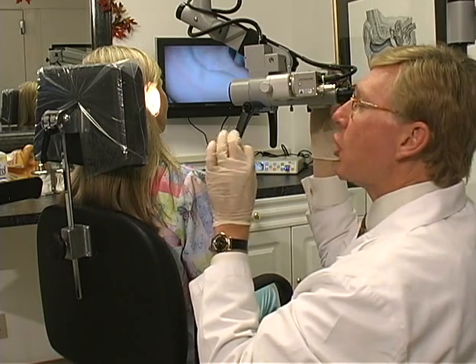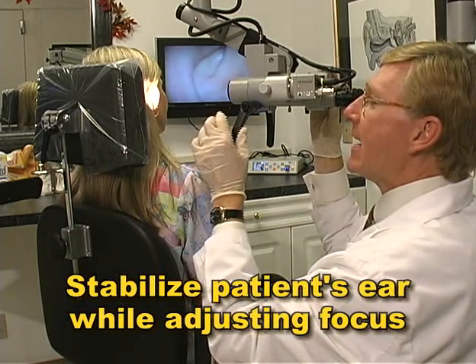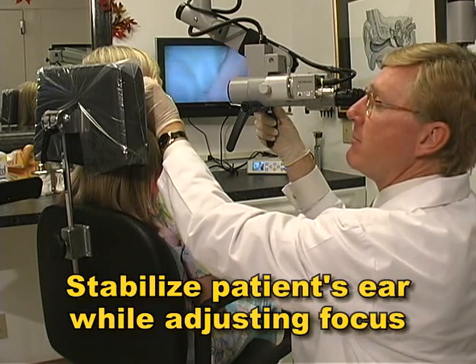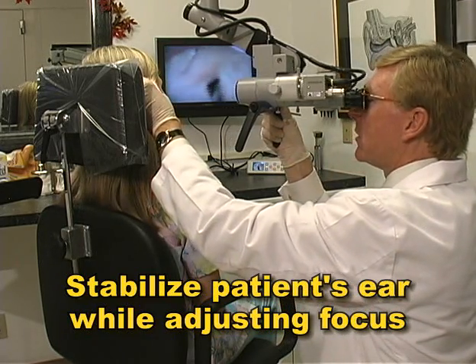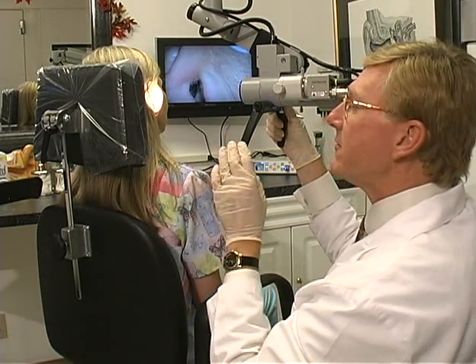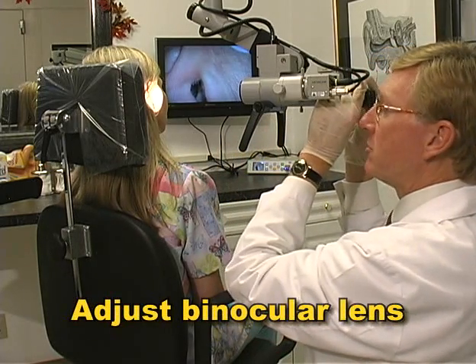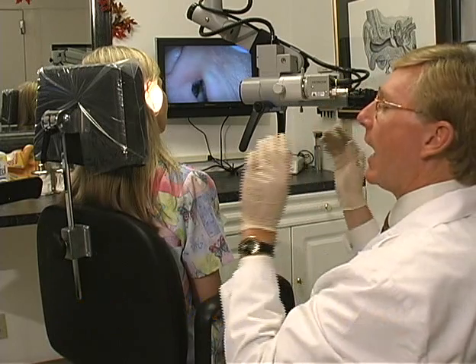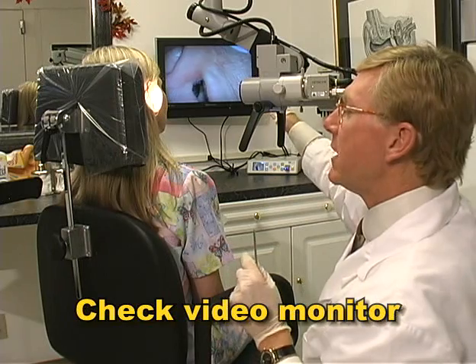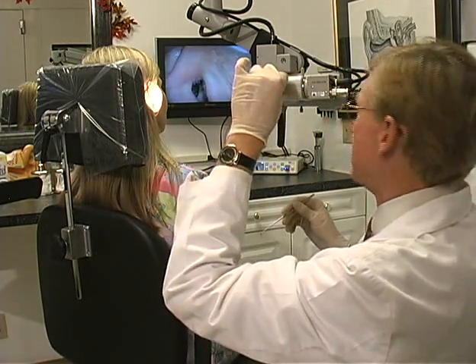Now with the scope positioned correctly, look through the binocular lens and stabilize the patient's ear. Adjust the gross focus by moving the microscope in and out until you achieve the correct focus. Once focused, make sure that the binocular lenses have equal vision between eyes. At this point, it's a good idea to look at the video monitor to make sure it's in focus, since it may be different from what's seen through the microscope.